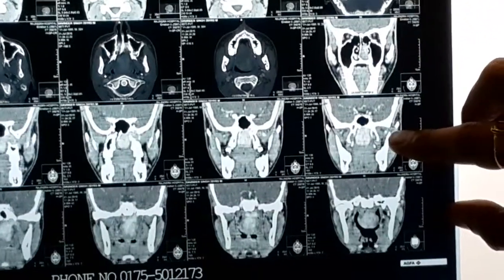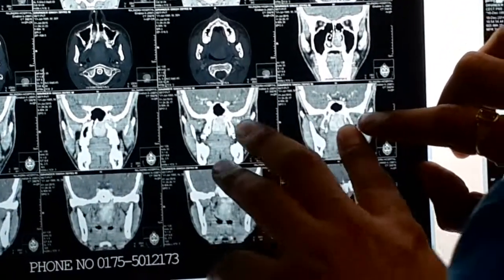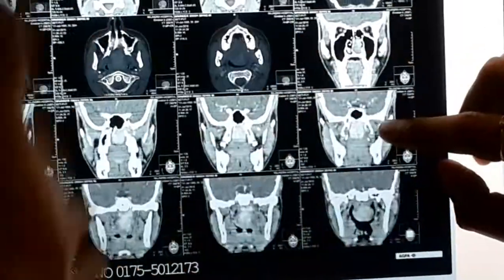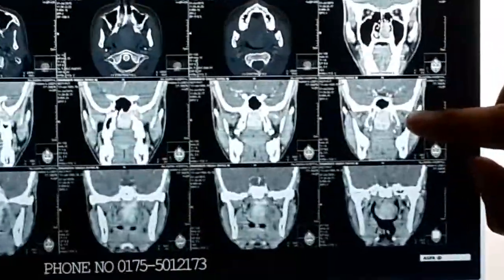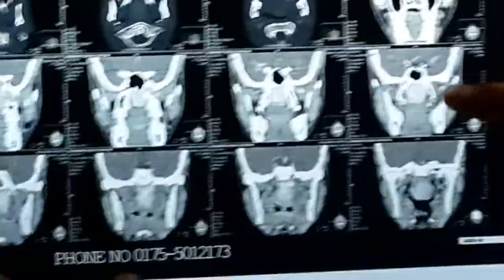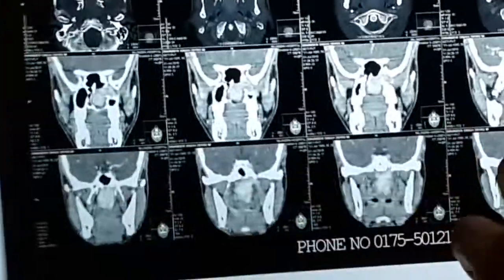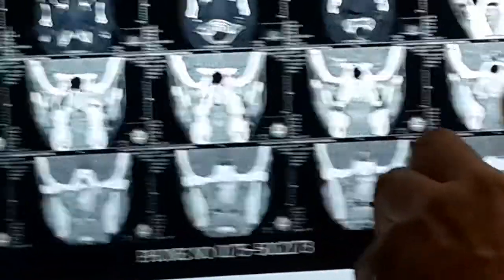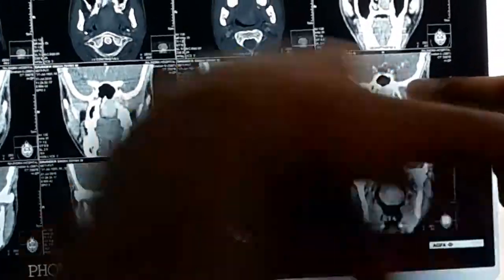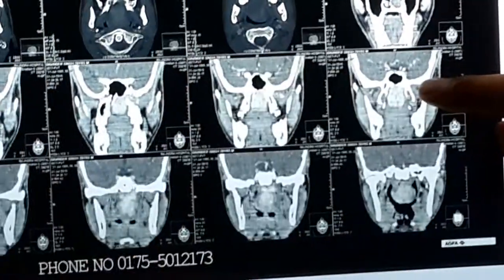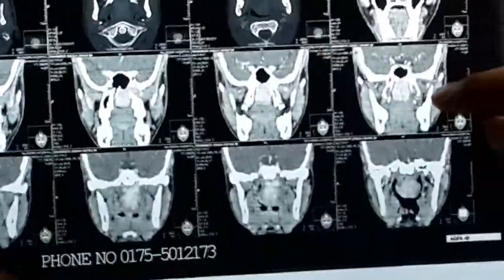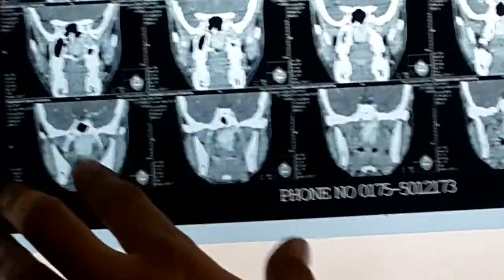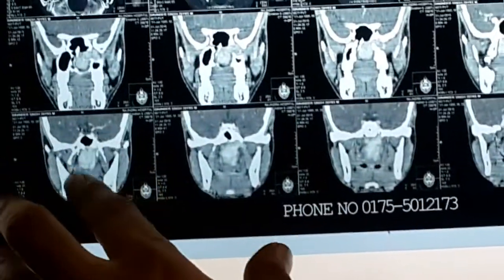Nowhere is this tumor going behind the pterygoid process because the pterygoid process is intact. In that situation where it does erode the pterygoid process and goes behind — the next case has a pure parapharyngeal extension; that is a revision case. And this is the component in the nasopharynx. Not going into the sphenoid sinus at all, though it is reaching up to the floor of the sphenoid, eroding the floor, but not going inside.